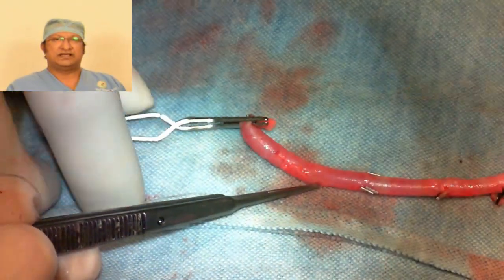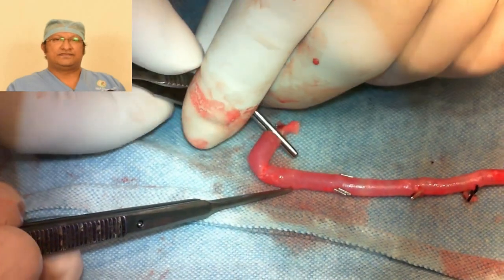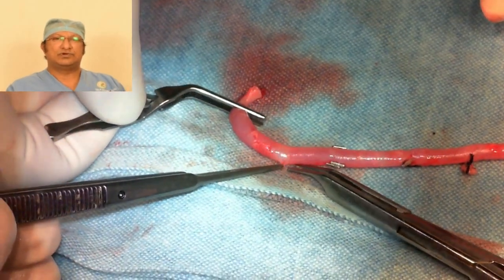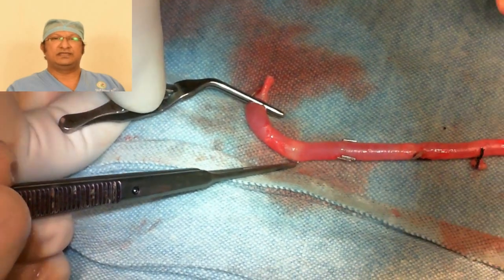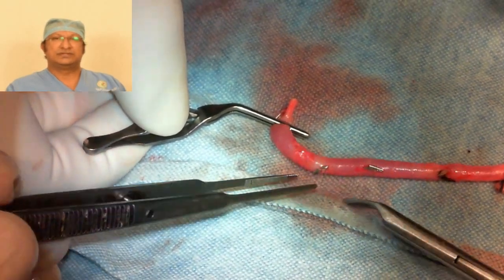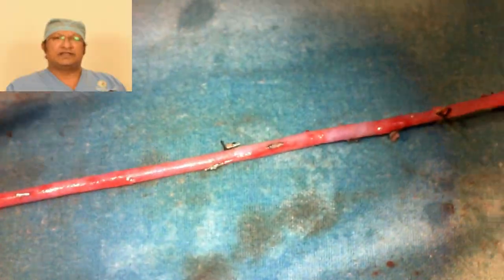We are giving more importance to the way we handle the vein, as covered in the last video. This video will deal with what has to be done after the vein has been harvested. The first point: always look for avulsions — any small branches that have been avulsed from the main vein. They will look like small holes and may not bleed as of now.